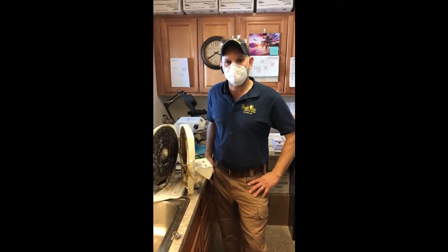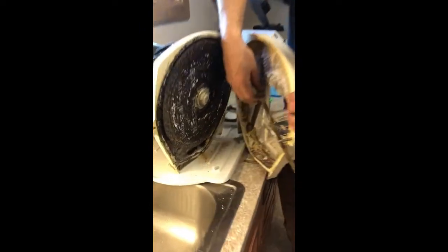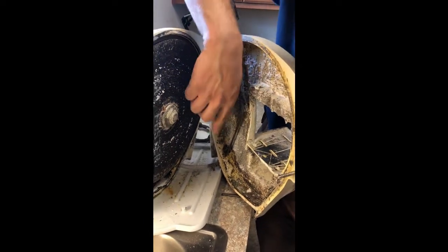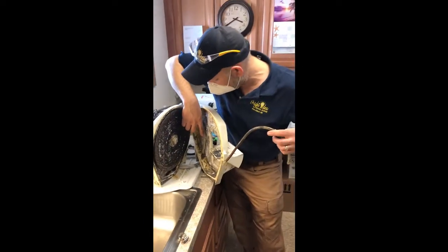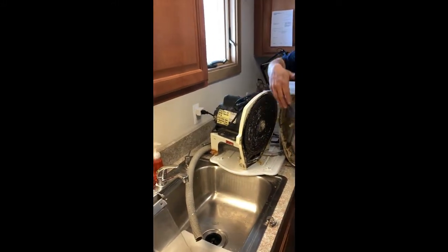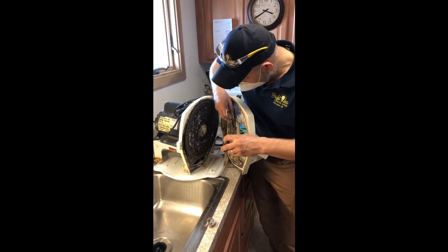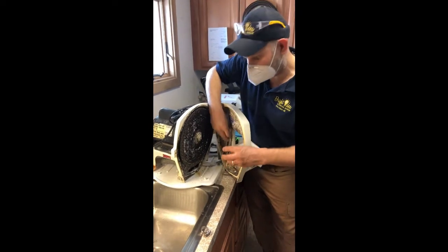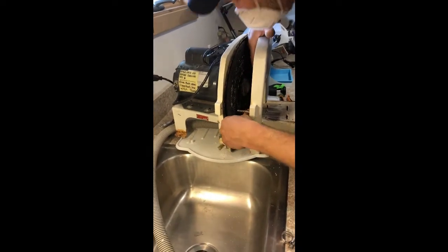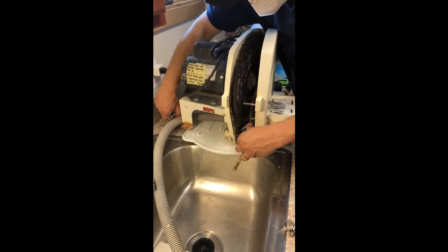Okay. What we've done is we put in a new hose. After we cleared all these holes, we cut the end, and we fed our wire in there to clear it. We have a new hose that's coming over here to the wall, and now, while it's still open, we're going to flush everything out. So I'm going to put this old hose back on here, and this is going to direct the flow out. We're going to close the door, and I'm expecting there might be some old biofilm come out, but essentially I'm expecting some water flowing from this point.